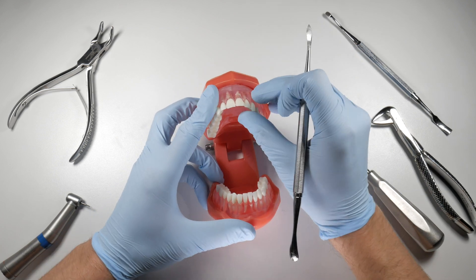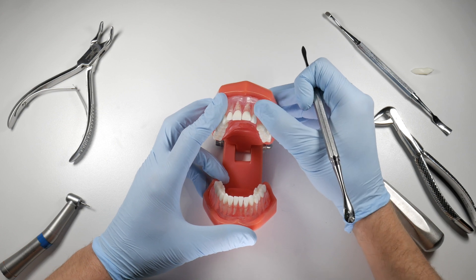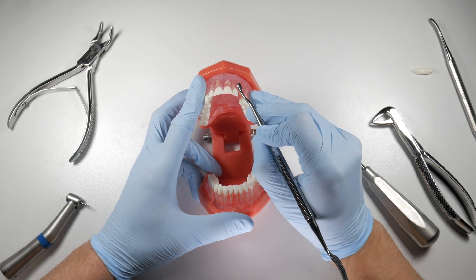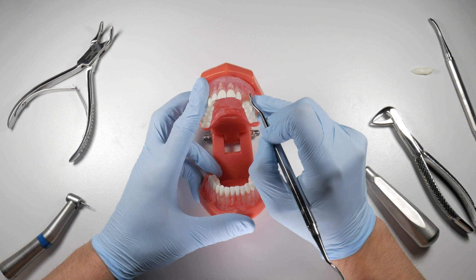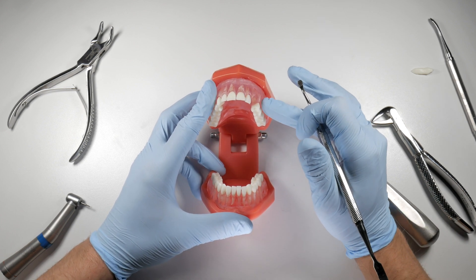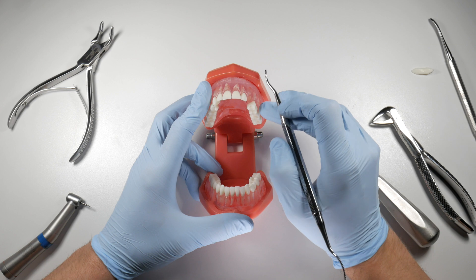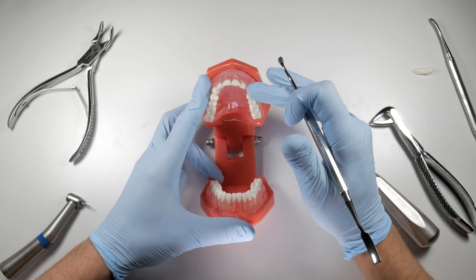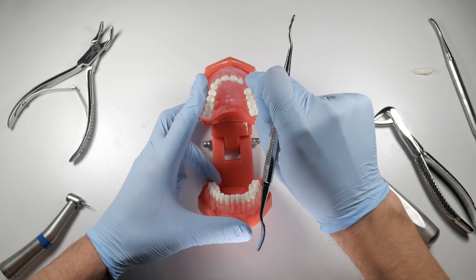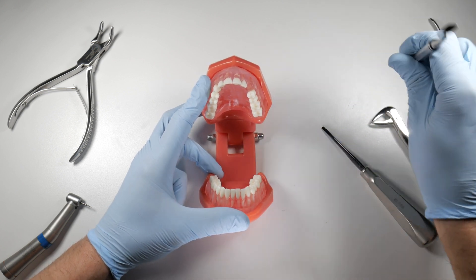Once the tooth is out, palpate the area — if you feel mobile bone or sharp edges, that's another reason to have undermined the flap, so you can access those regions with your bone file. Using pull strokes, smooth down the bony edges from the removed plate. Feel again when done to ensure it's smooth; if not, use a rongeur to clip a bit more bone, go over it again with the bone file, then irrigate thoroughly with a monoject syringe and sterile saline. Use a narrow suction tip — white or blue — to get under the flap to the base to remove all bony spicules.